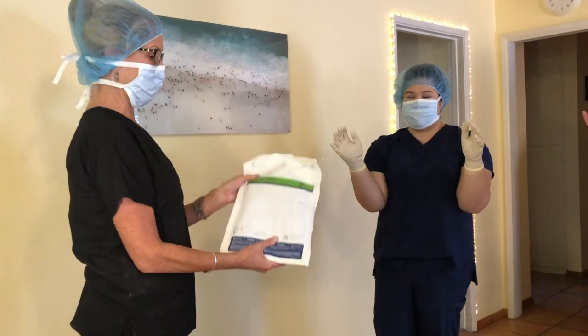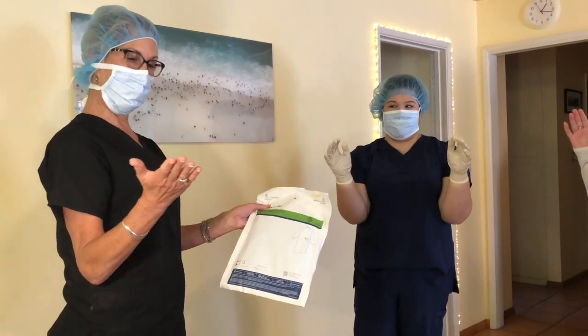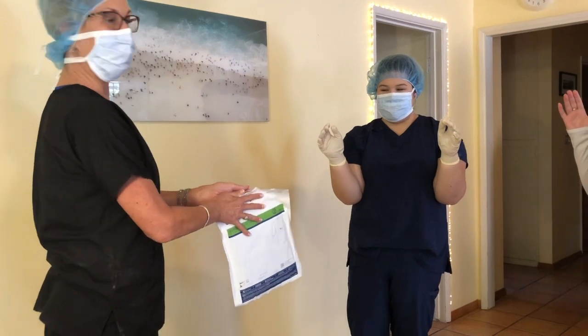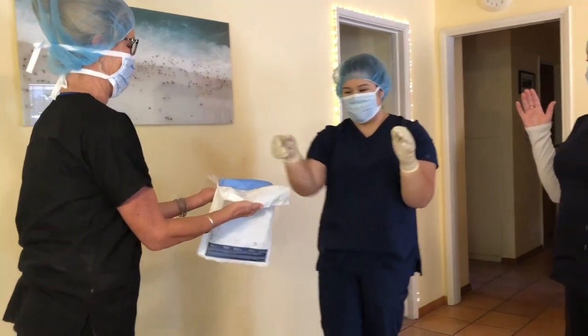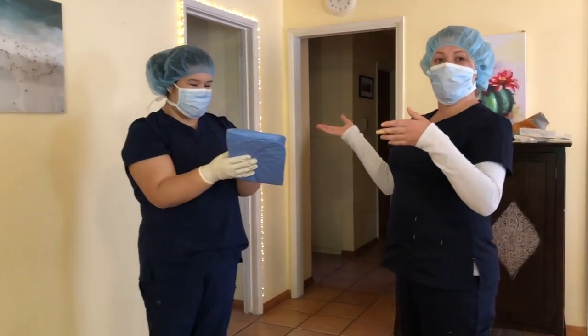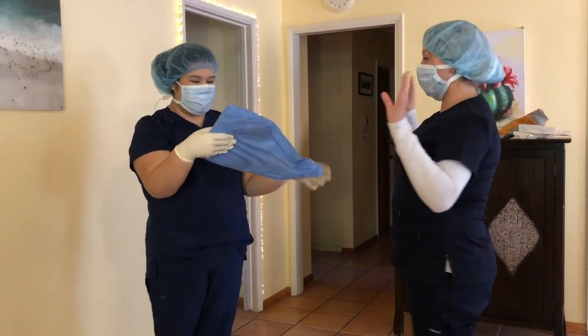Opening the sterile gown. I am not sterile, however, I will be carefully opening and handing it to Stephanie, who is sterile. And now she will hand it to me. I'm the radiologist.